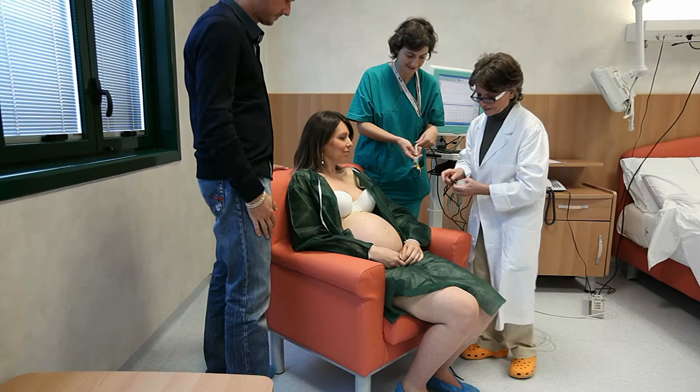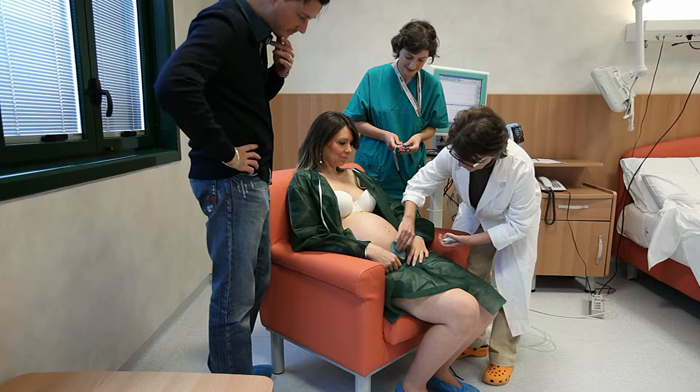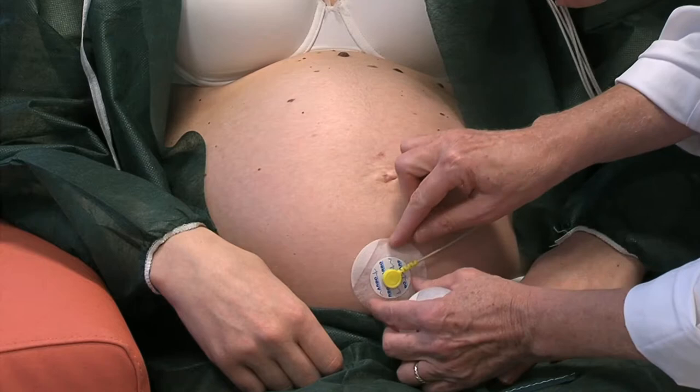Come si può evidenziare nei successivi fotogrammi, si prepara la cute con un leggero scraping e quindi si applicano dei sensori monouso in sezioni cutanee dell'addome materno topograficamente prestabilite. Tali sensori sono collegati al rilevatore di segnale bioelettrico.